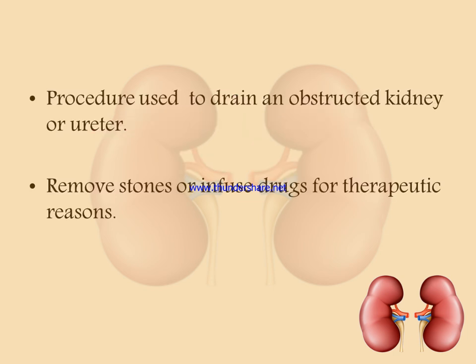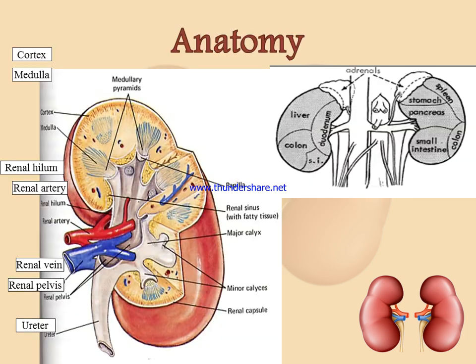Nephrostomy or ureteric stenting is a procedure to drain an obstructive kidney or ureter, and it is also used to remove stones or infuse drugs for a therapeutic reason. There are many types of disease. In therapeutic cases, we remove stones or infuse drugs in this procedure.